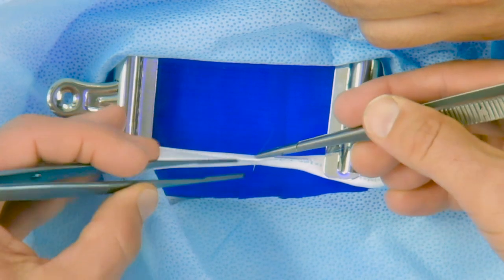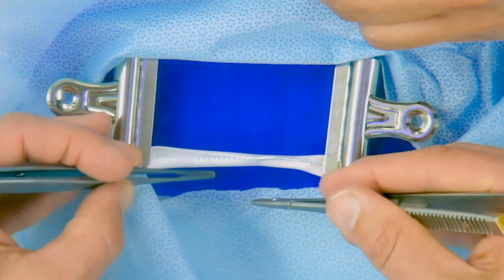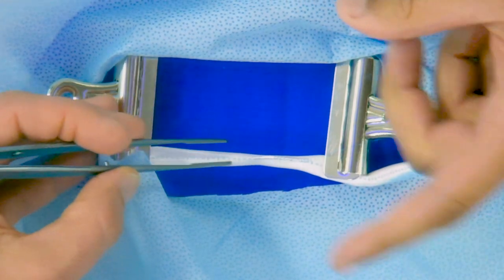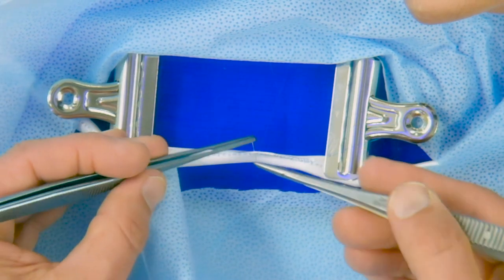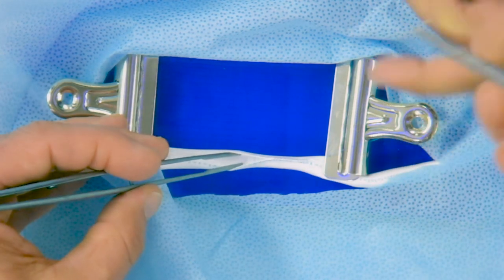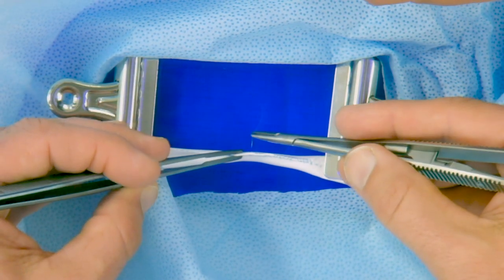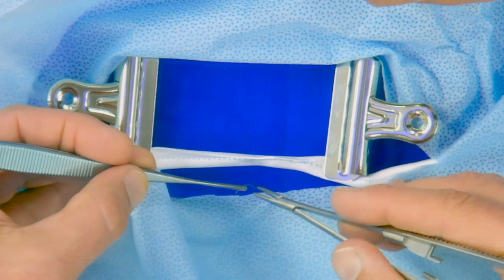After each bite, note that we'll grasp the needle at the forward portion and use the other instrument to rotate around at that pivot point to simply swivel the needle so that we can enable it to be grasped again in the proper place. Grasping forward, swiveling, and then grabbing, orienting, and then pulling forward. That way we're prepared after we pull up to come back down and take the next bite.